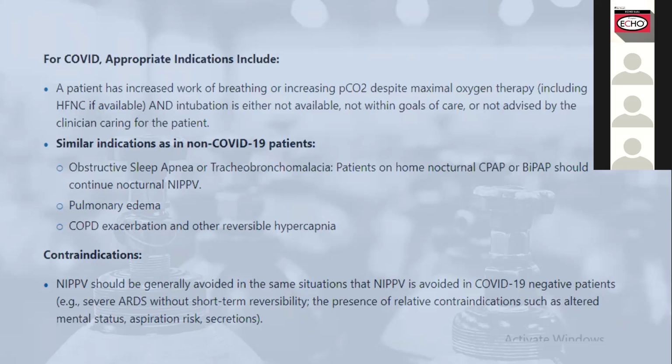And you want to avoid delivering oxygen using this non-invasive positive pressure ventilation for patients who are going to require CPAP or BiPAP for a long period, like more than 48 hours.